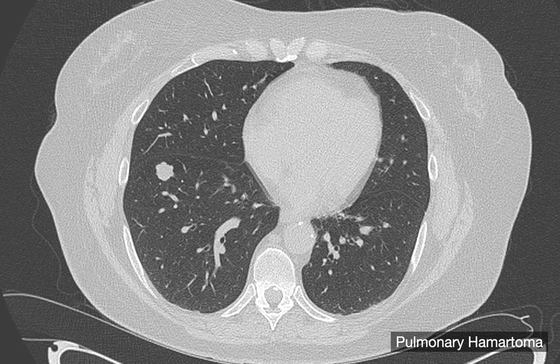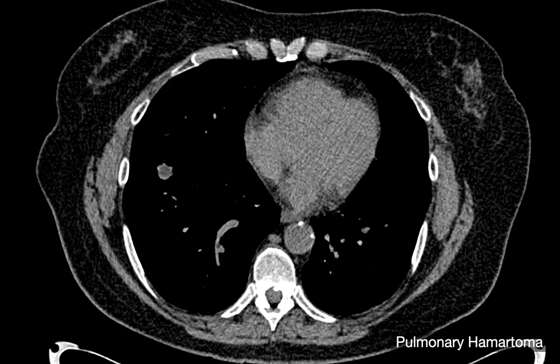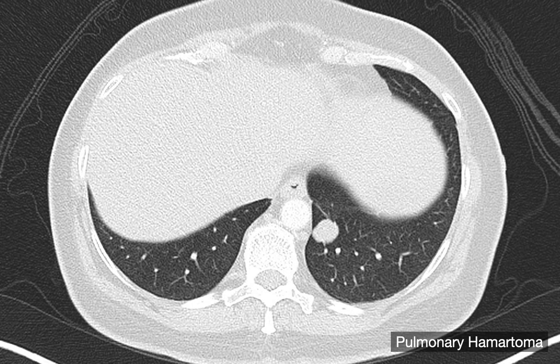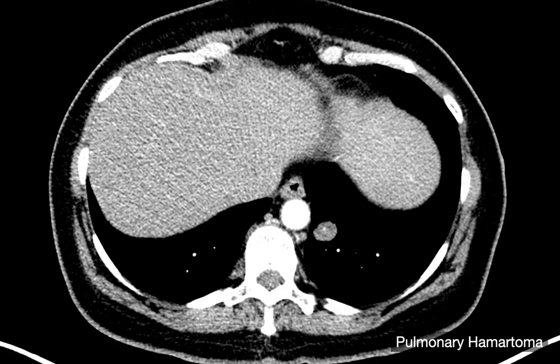Not every pulmonary hamartoma, however, presents specifically. Here is a pulmonary hamartoma in the right lower lobe — on soft tissue window, this nodule is almost the same density as muscle. This is the type of pulmonary hamartoma which is presenting nonspecifically, which will eventually require some sort of follow-up imaging, if not a PET scan or sometimes a biopsy. Here's another example of a pulmonary hamartoma in the left lower lobe which did not present specifically.